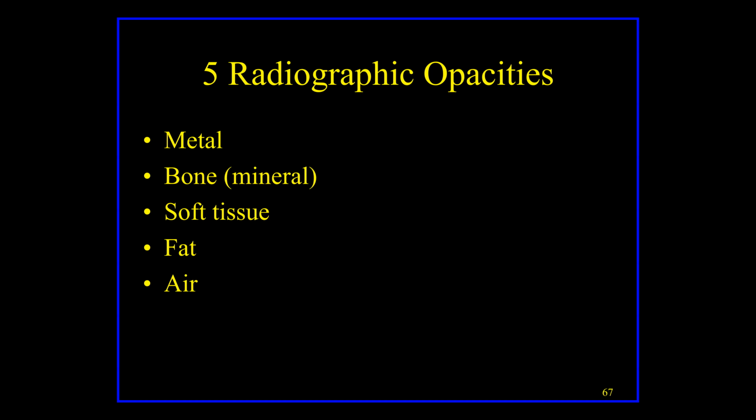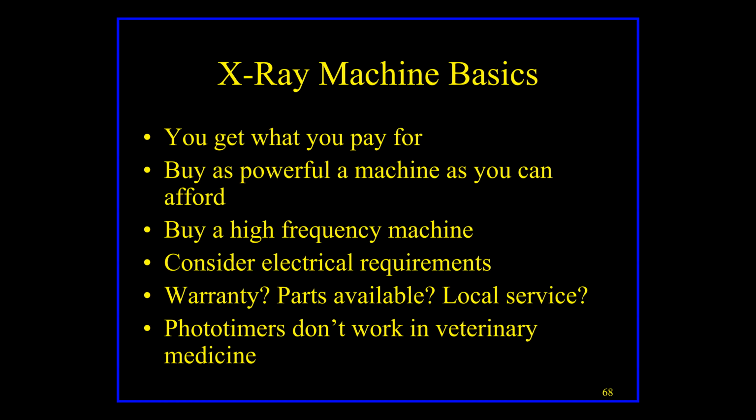But in reality, if you want to sound like a real doctor, you should probably get in the habit of telling your clients and your associates that we're going to get radiographs instead of we're going to get X-rays. And we're going to look at the radiographs instead of we're going to look at the X-rays. You actually can't look at X-rays, right? So it's semantics, but it's also kind of important.